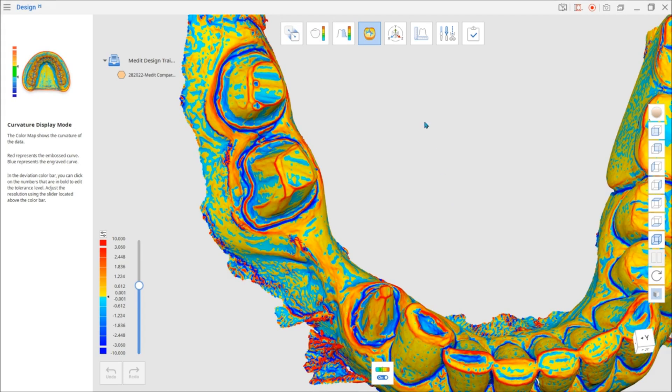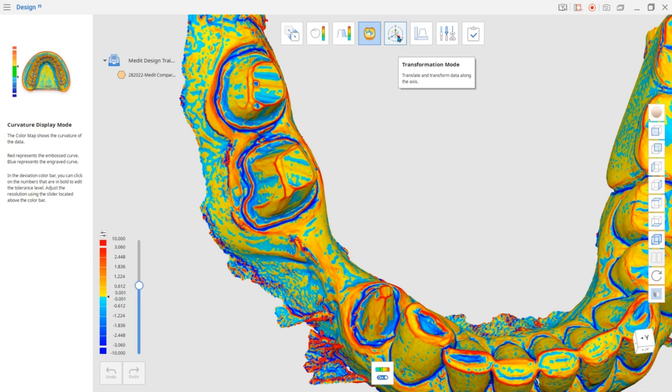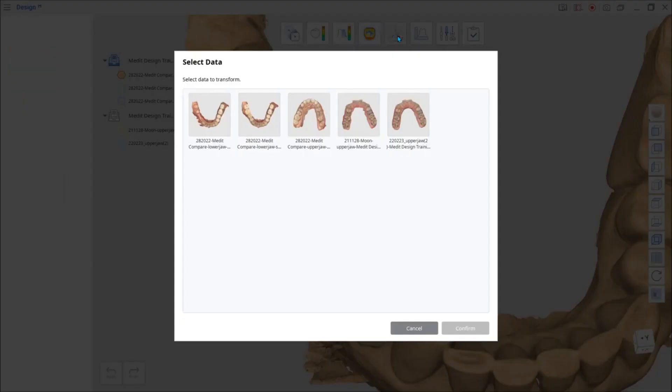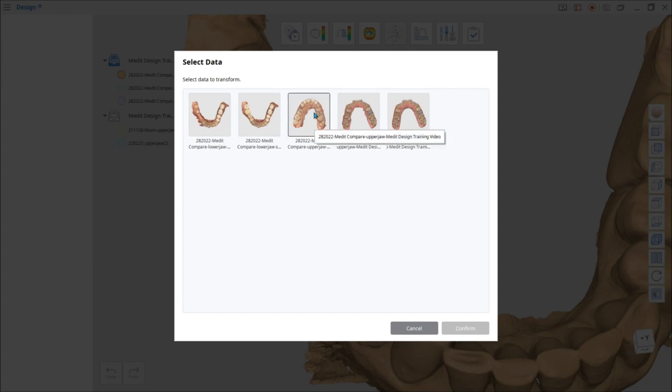Now let's look at the Transformation Mode. In this mode, you can transform data along the axis or modify its size. First, select the data you want to change. The data selected for transformation will be outlined.